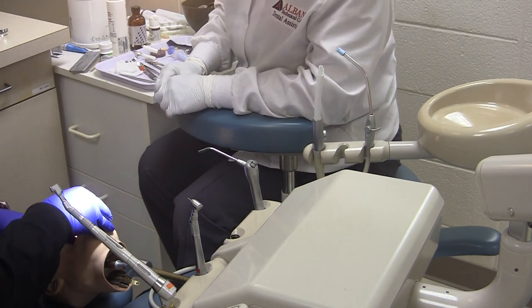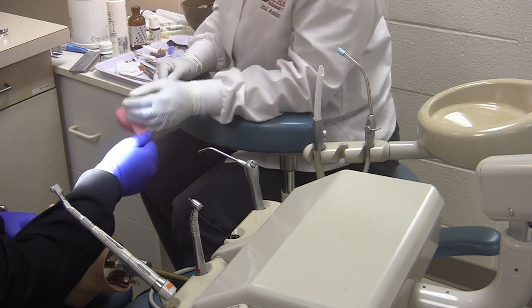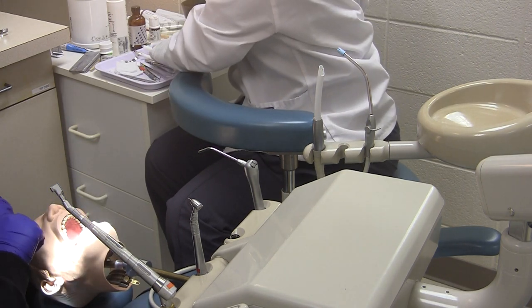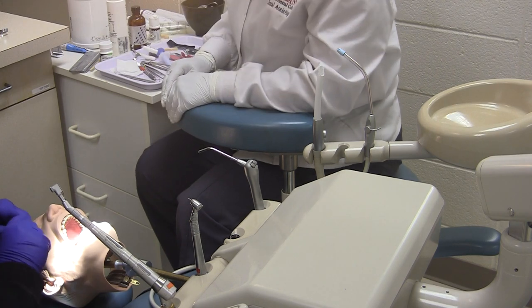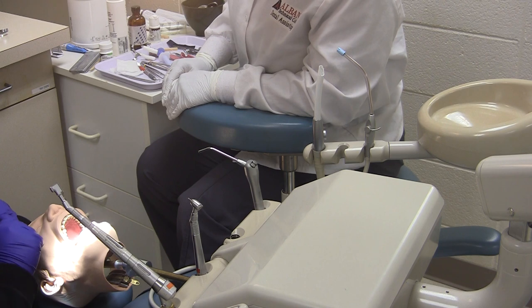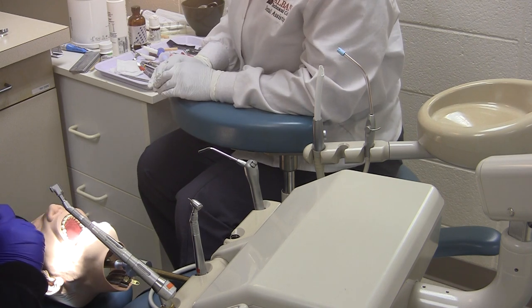After the final impression has set, we will check the impression and then take our bite registration. We will then take our bite registration. Bite registration looks good.